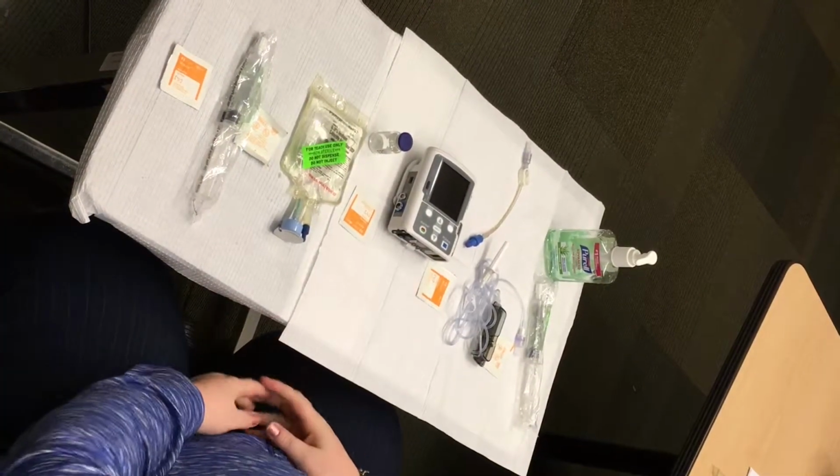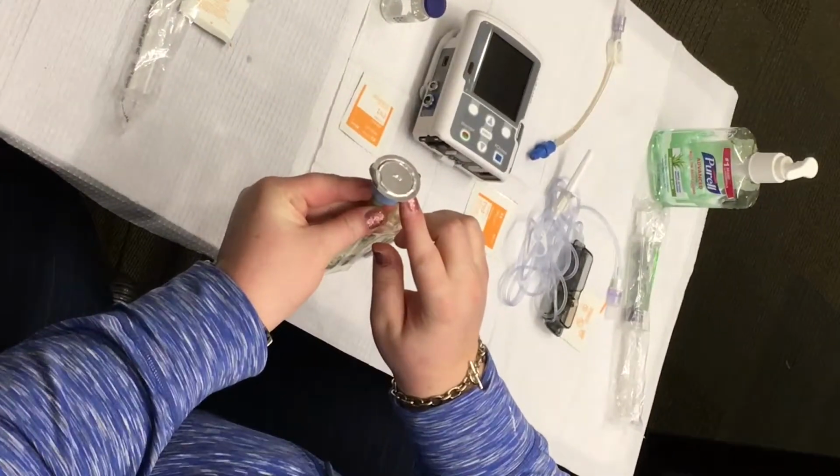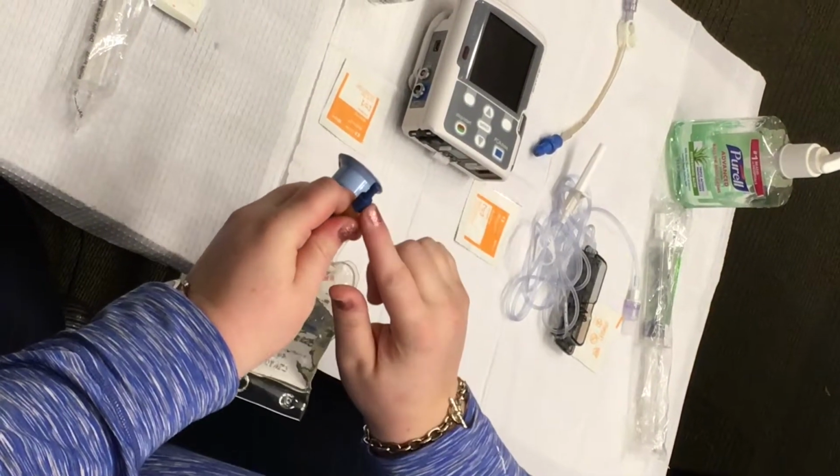The mini bag has two ports. The wide port has a bell-shaped blue plastic drug vial adapter with a foil cover over the end. The narrow administration port is where you'll be inserting the IV tubing.